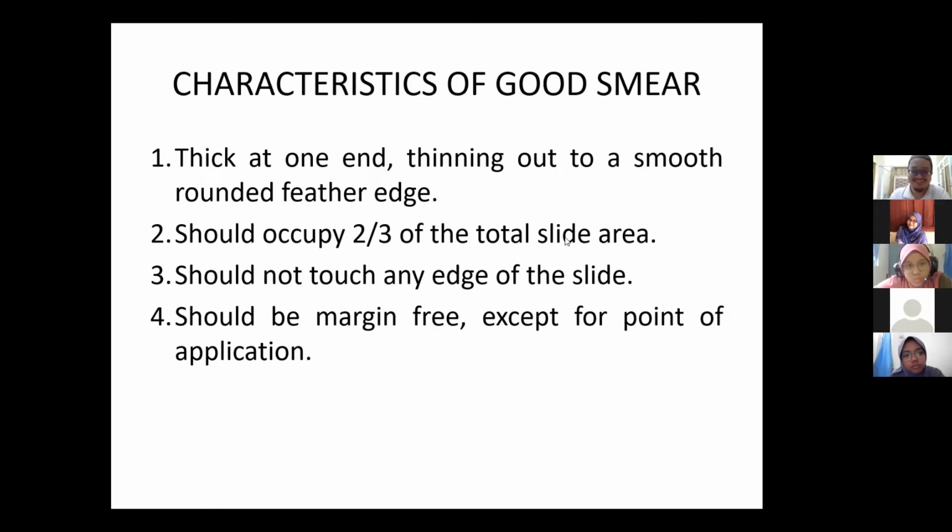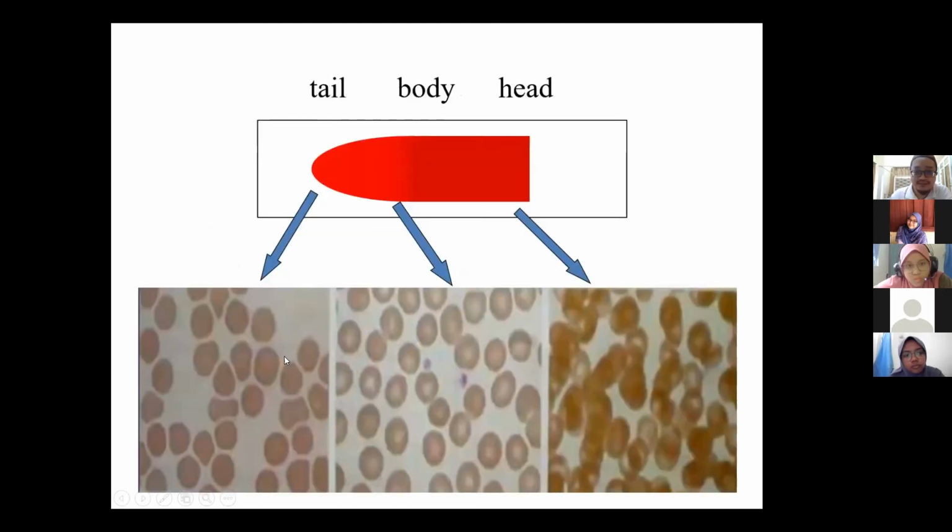Okay, it should occupy 2/3 of the slide area, about 70%. It should not touch any edge of the slide. It should be margin free, except for the point of application. So these are the parts of the smear. There's a tail. It should be a nice feathered tail.